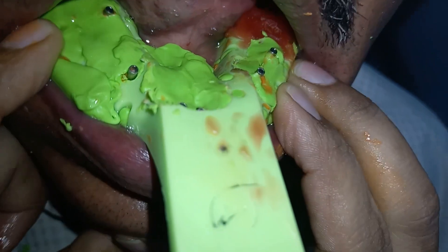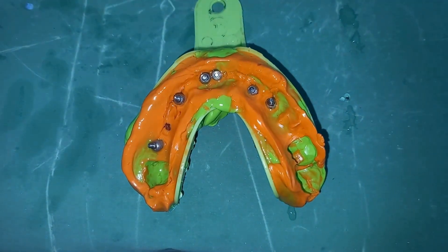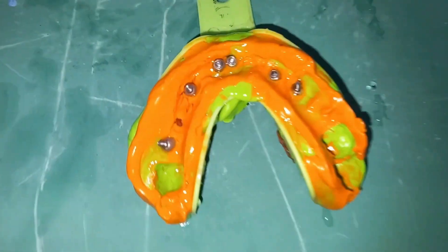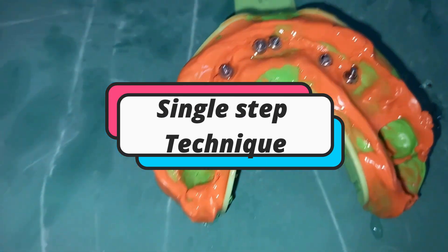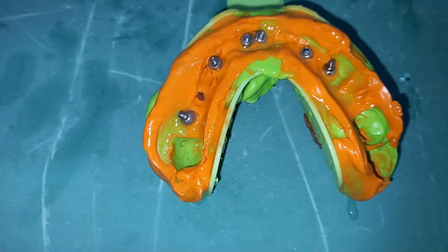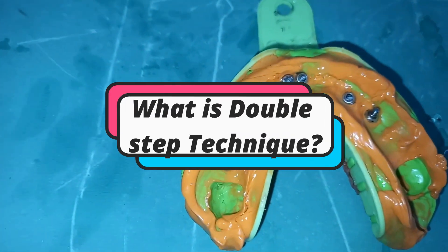Wait for the impression material to set before taking it out. The putty material and the syringe light body material set simultaneously, and that is why this is called the single step technique.